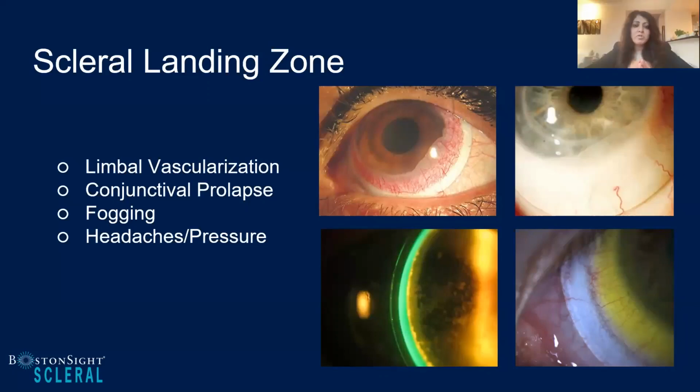One thing to remember too, we've both mentioned this earlier, is that this lens is going to settle the longer that it's on the eye. So all our patients are different. Some will settle the most within the first couple of hours. Some will take up to a week before they have that full settling effect. And remember, what happens when they settle, that lens gets tighter and tighter and tighter. So you have to make sure that you bring people back at these different intervals.